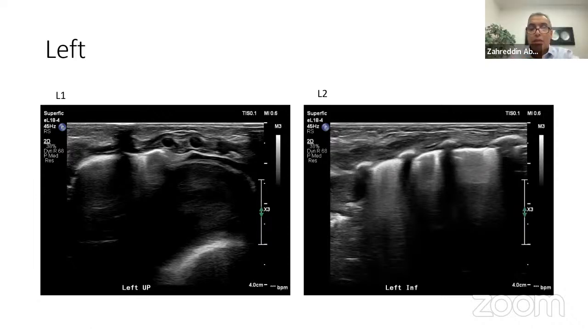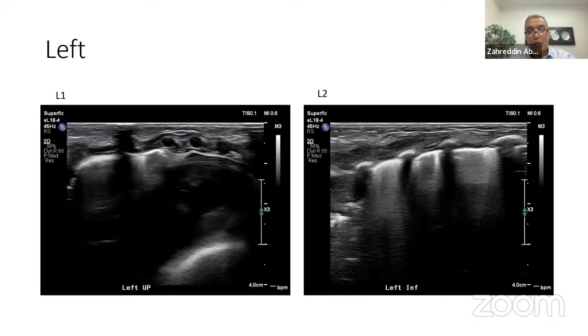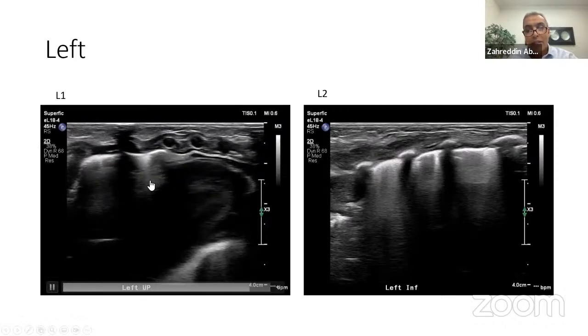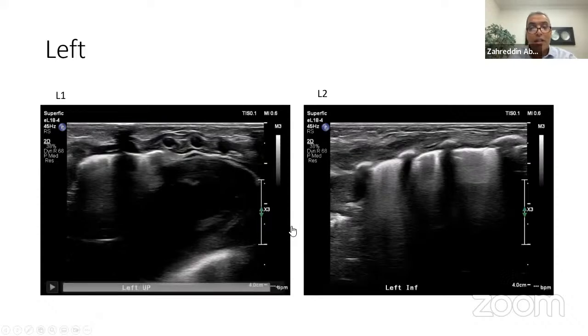Just a quick question. About meconium aspiration, we know that B lines in other conditions may indicate clinically that you need to take an action, like increasing the pressure on the ventilator. But in the particular situation of meconium aspiration, does the predominance of B lines affect your clinical decision in terms of ventilation strategies? I mean, at this point you'll probably be thinking of oscillation or even nitric oxide if there is a PPHN creeping into the picture. So what is the implication of lung ultrasound in meconium aspiration?